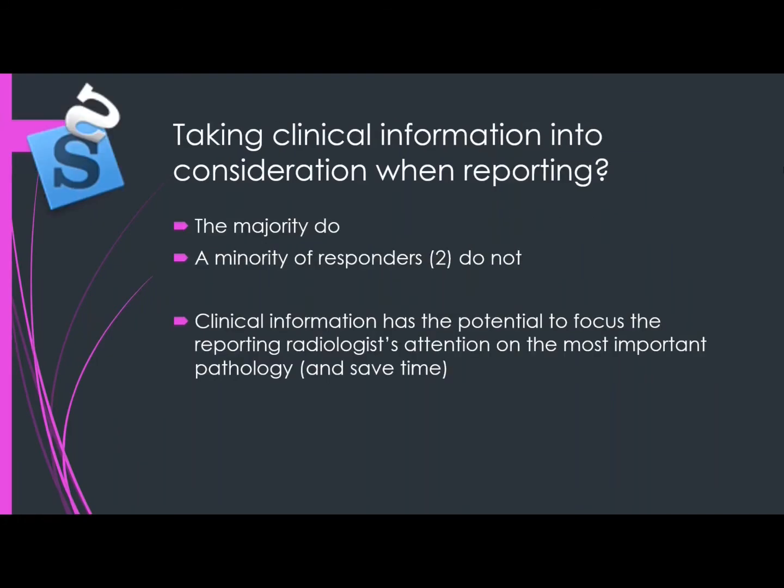We must take into account another topic that is not currently among the respondents with a full consensus. The majority of reporting radiologists say that they would always have the patient's clinical picture into consideration when looking for pathology on the imaging, thereby possibly discovering any pertinent pathology very quickly, but also potentially omitting any smaller findings which are not relevant to the current clinical picture.